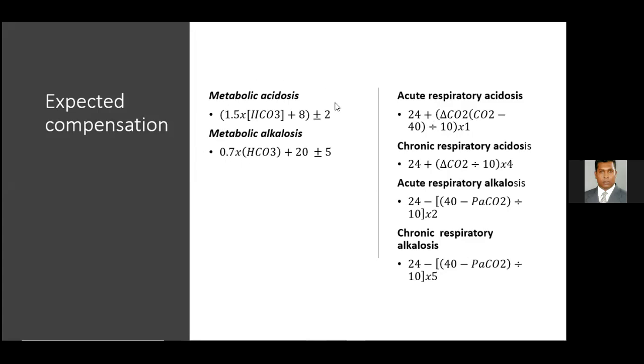But see these and go through these and see whether you can work out how these things are calculated. Now I said earlier, in certain situations, you take a cutoff point rather than the range. Now, this is a situation where you take the cutoff point.